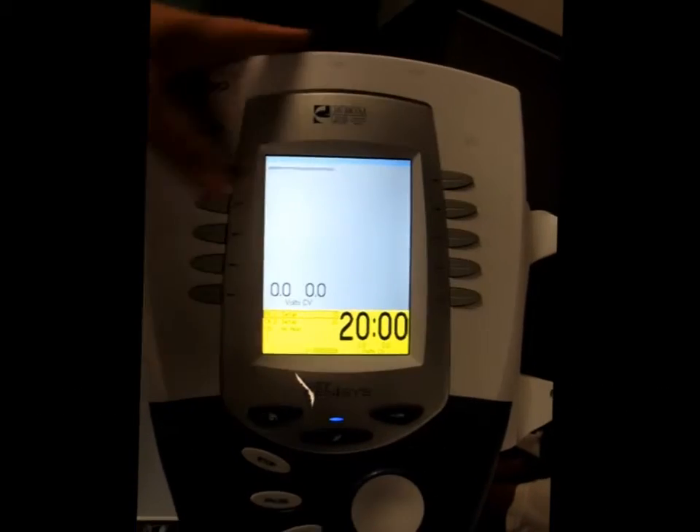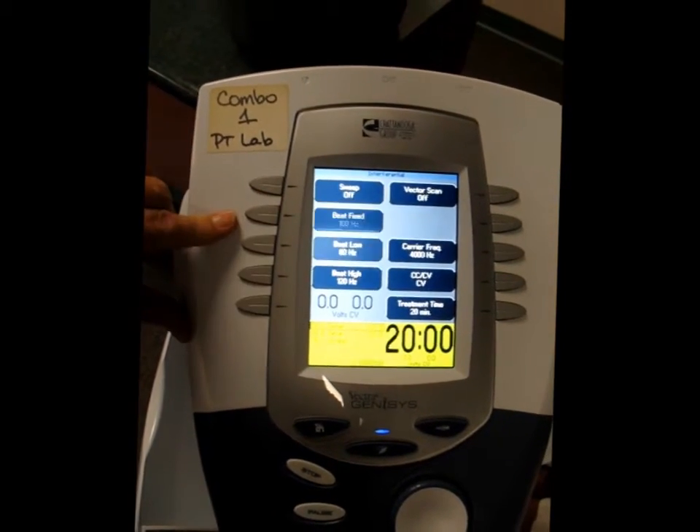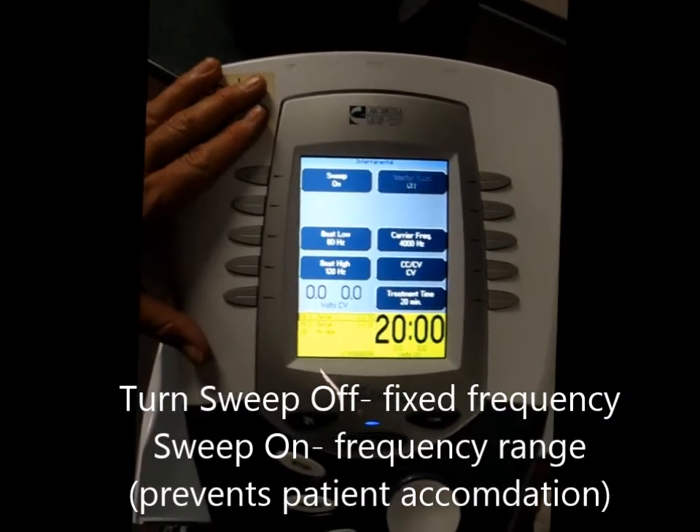Beat low is 80, beat high is 120. Sweep is on. If I turn the sweep off, it's fixed to 100 hertz, and I could always change that too, but I'm not going to. I'm going to put that sweep back on.